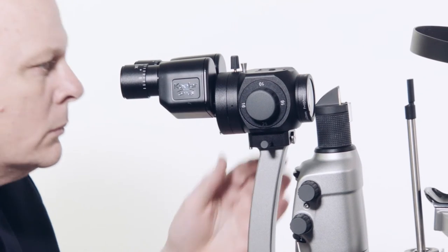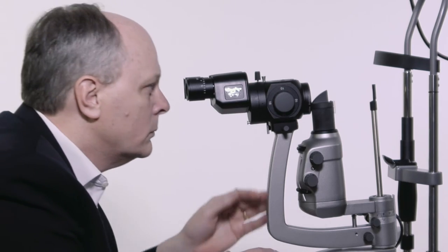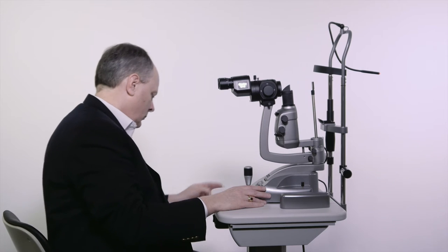The yellow filter can be inserted and displaced by using this plunger. When the examination is complete, set the rheostat low and switch off the slit lamp.